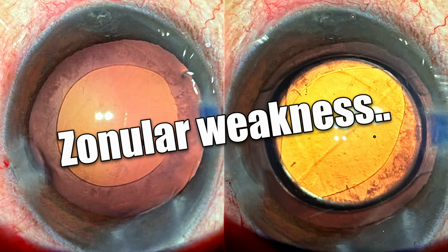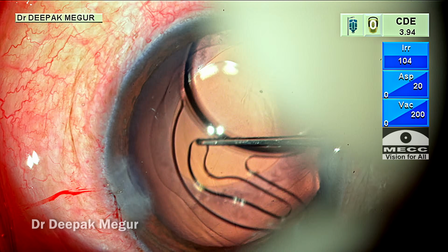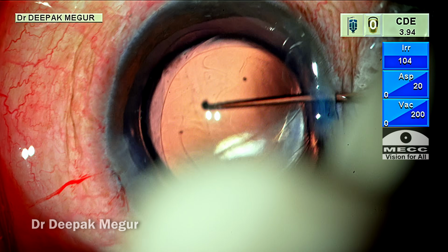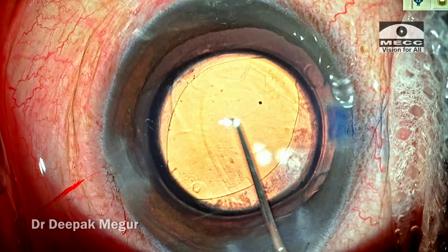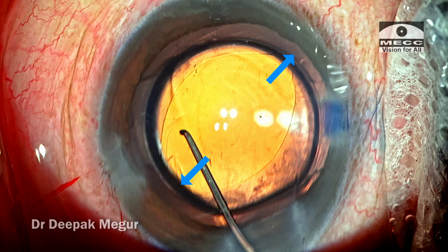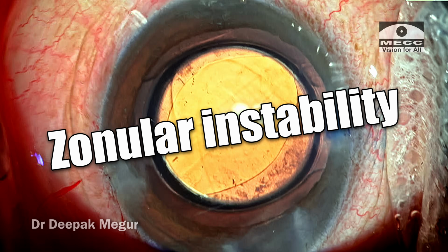Well, this indicates zonular weakness. The moment the bag is filled with an intraocular lens, the area in which the haptics are there, that meridian is stretched, and that is the reason we are seeing the ovalization of rhexis. If you see, the ovalization of rhexis corresponds to the area where the haptics are stretching the equator of the bag. So this is possible only when there is zonular instability.